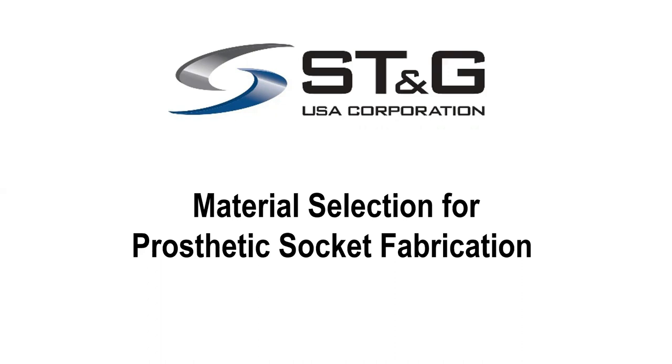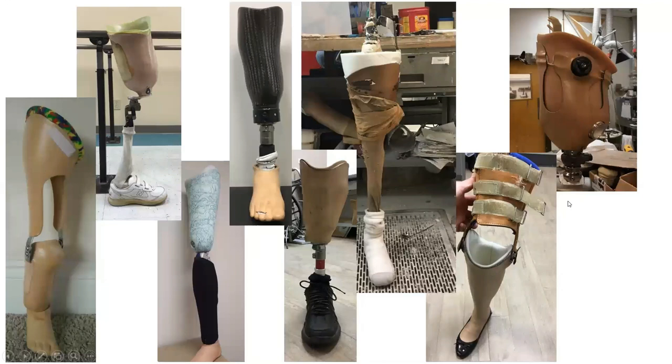Today we're going to talk about different types of prostheses that we normally would encounter. One of the things we want to look at is the different types of prostheses that we want to make. If we look at this wide variety of different types of sockets, there are different levels, but also different functions. We have some with joints and thigh lacers. We have some that are weight-bearing joints. We also have flexible sockets. We have elevated vacuum. We also have adjustable brims with a click medical device.